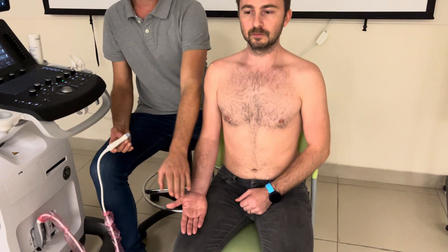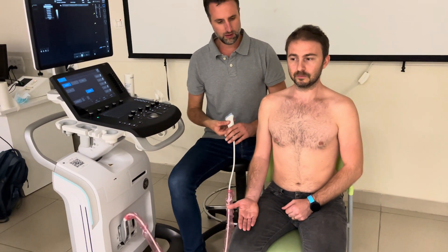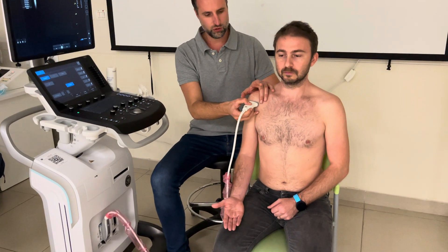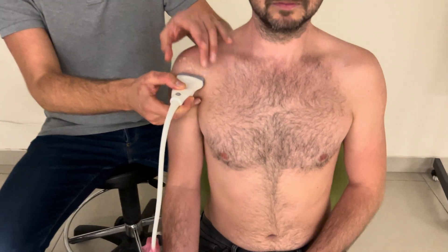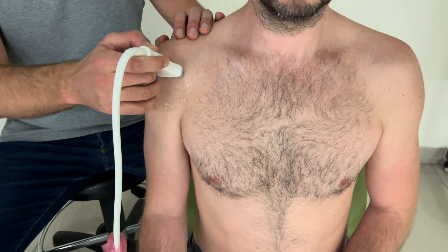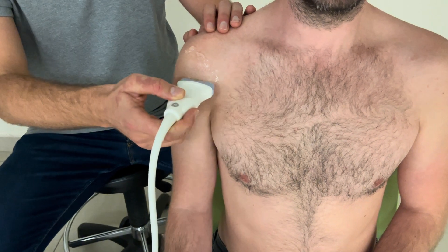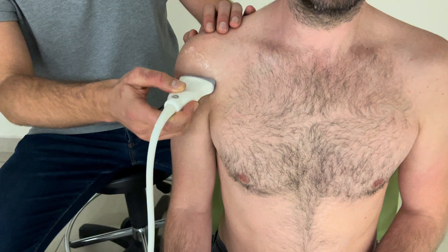We're going to scan the anterior shoulder. The position we use is that we put the hand in an open position in supine on the leg — the arm is just resting in a relaxed position. We start with a transverse view, or short axis view, of the biceps tendon. Importantly, you have to be either in the transverse plane of the body or even angled a bit under — not tilted upward.